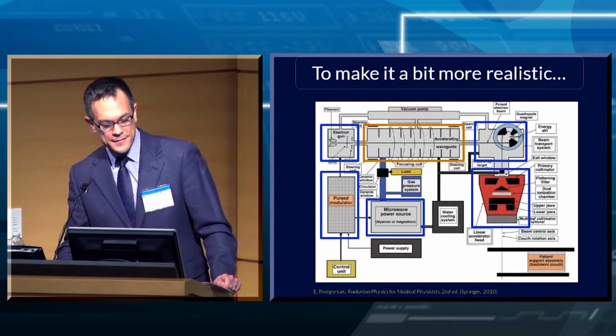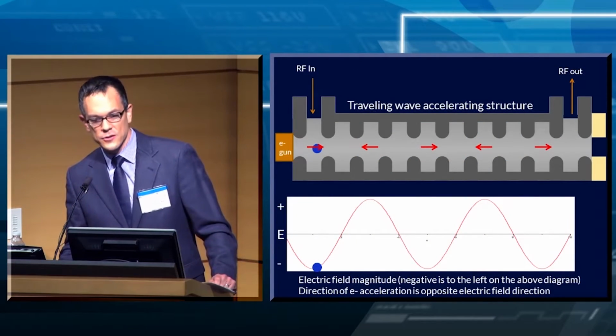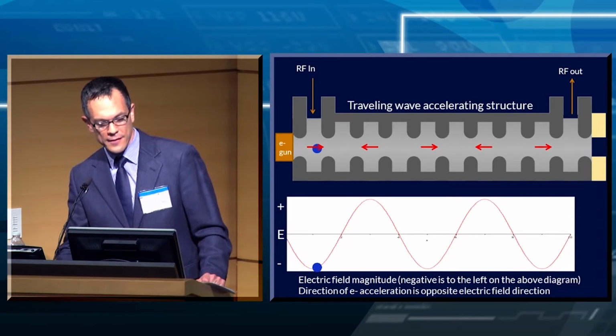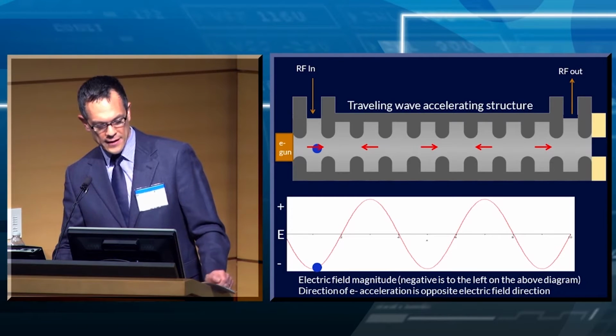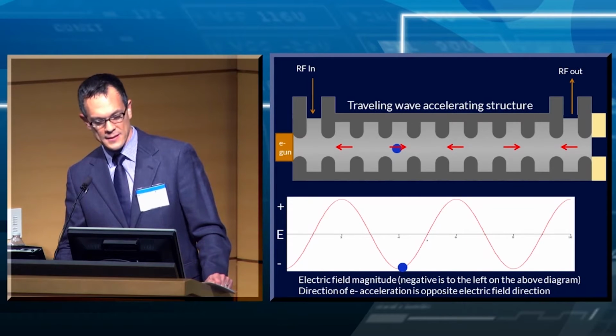So just to briefly focus on the waveguide for a second, the way it works is a waveguide is basically a tube with different sized cavities cut in it, and the frequency of the microwave radiation that's coming in causes resonance within the cavity and basically causes alternating positive and negative charges on the walls of each cavity. And so if you have an electron bunch that comes in at the same time as the waveguide, then you can make the electrons basically surf along the cavity. So it kind of looks like this. So that's basically what happens.